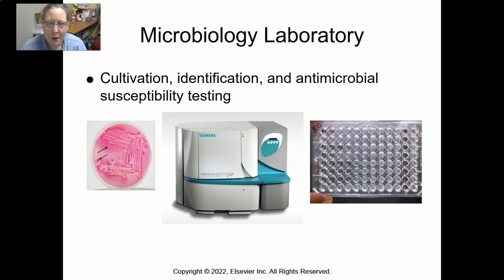This is the first lesson in the medical microbiology series, and we're going to talk about specimen management. In the microbiology lab, we generally grow bacteria. There would be cultivation and maybe some yeast or fungi. And then we proceed with all the testing to identify the cultures that have grown on the petri dishes or the plates. And we do antimicrobial susceptibility testing so that we can make sure that the patient is receiving the correct antimicrobial, antibiotic, or even antifungal.